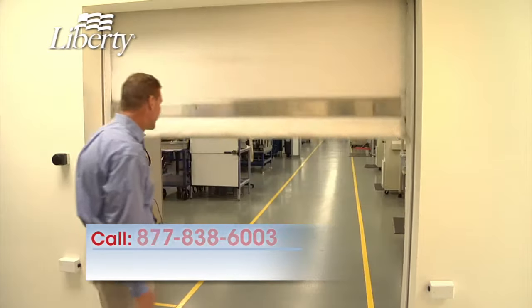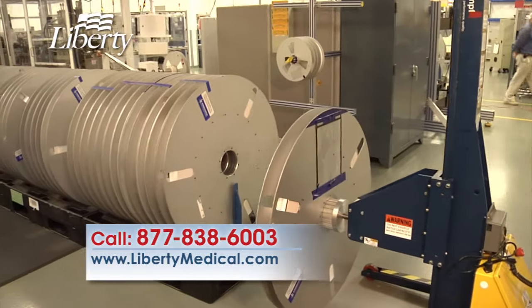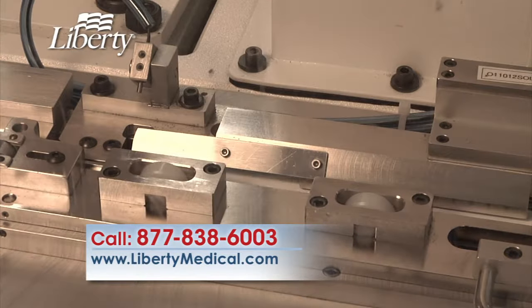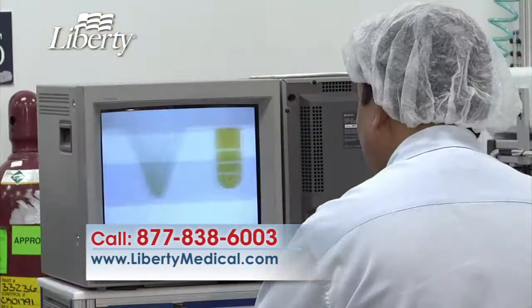Today you're going to find out during this exclusive tour of the facility where our strips are manufactured right here in the United States in Fort Lauderdale, Florida. In this state-of-the-art manufacturing facility, we have the capability of making millions of test strips per day. Every single test strip is manufactured here with a high degree of accuracy and precision to produce accurate results.